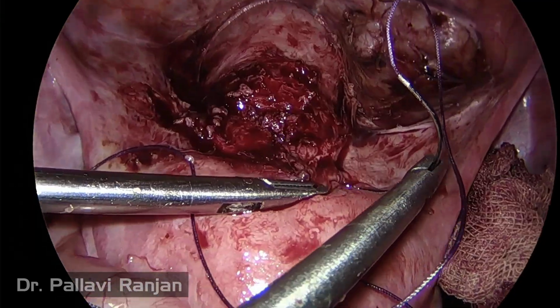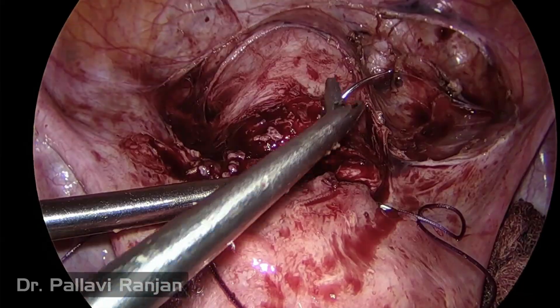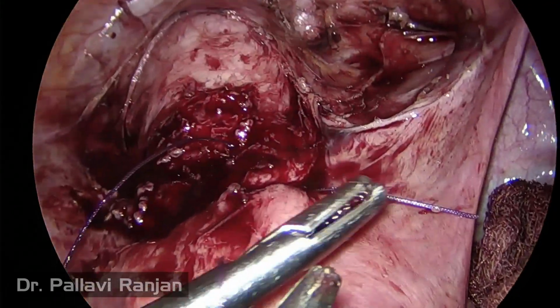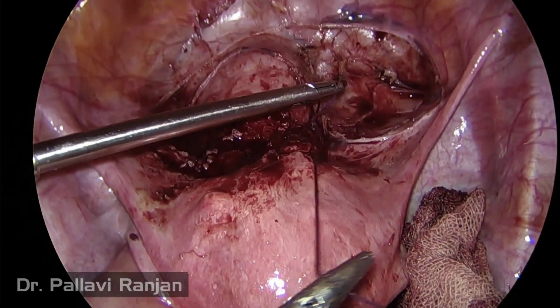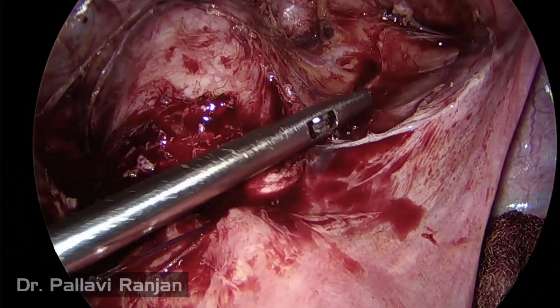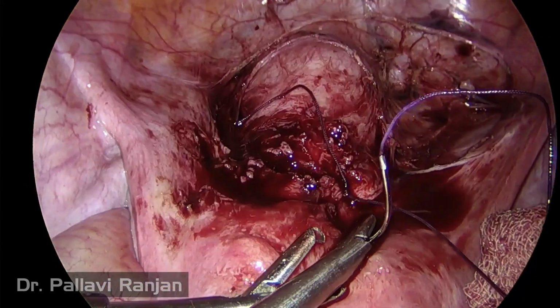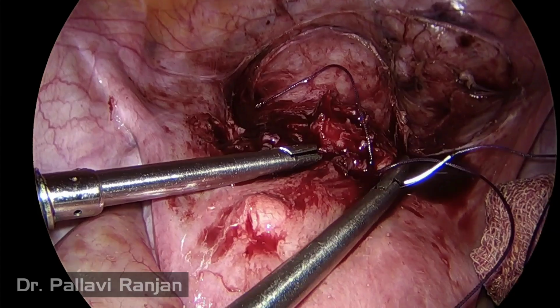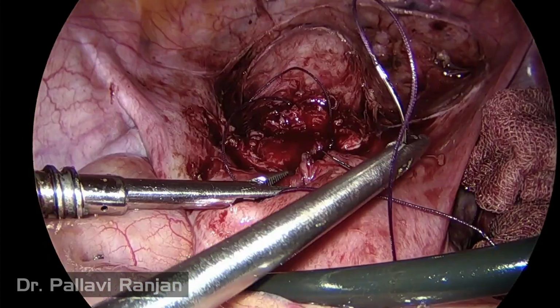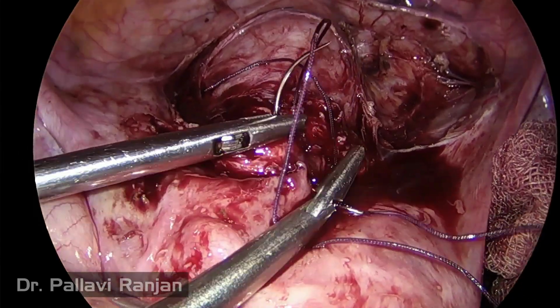Suturing is done with Vicryl number 1, round body, and one can use a barbed suture as well if the patient's financial condition permits, because barbed sutures are best when one has to suture, as they help in better approximation. But if not, then Vicryl is also good enough. But one has to ensure that you take full thickness bites from the upper edge as well as the lower edge to prevent isthmocele formation. So here we are doing continuous suturing.